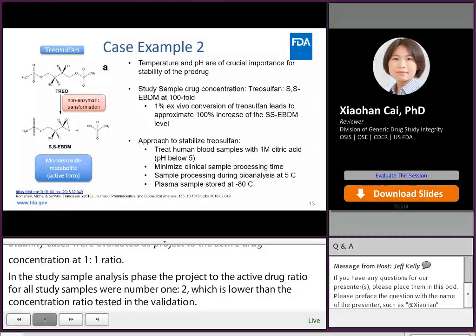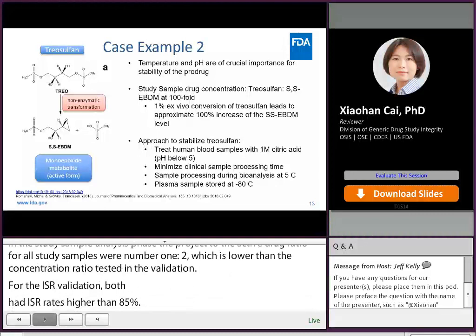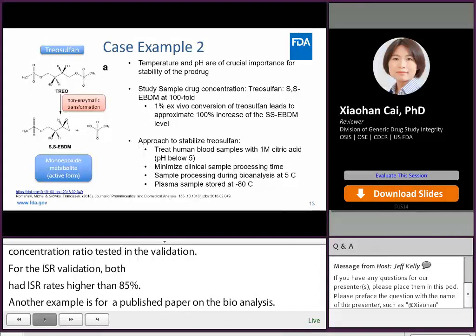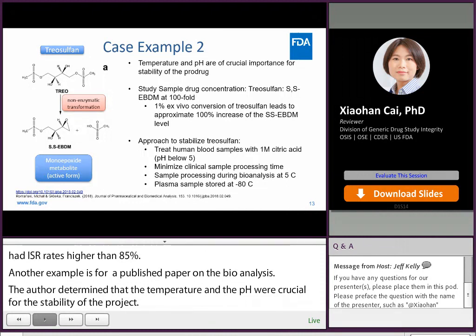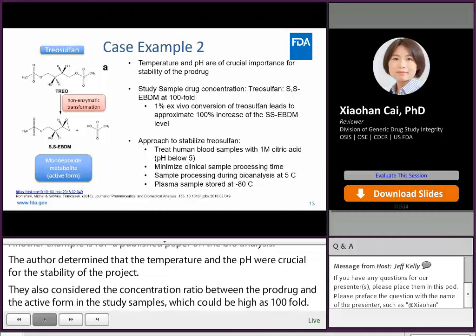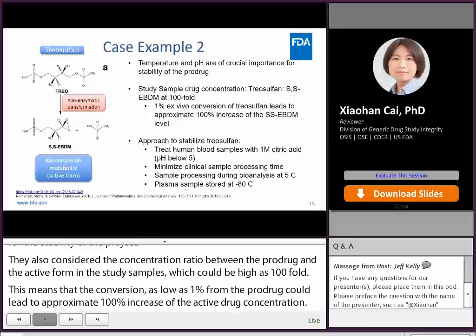Another example is from a published paper on the bioanalysis of treosulfan and its active form. The authors determined that temperature and pH were crucial for the stability of the pro-drug. They also considered the concentration ratio between the pro-drug and the active form in the study samples, which can be as high as 100-fold. This means conversion as low as 1% from the pro-drug would lead to approximately 100% increase in the active drug concentration. To minimize the conversion, the approaches implemented include treating human blood samples with citric acid to acidify the sample, minimizing sample processing temperature and duration, and storing plasma samples at minus 80 degrees C.